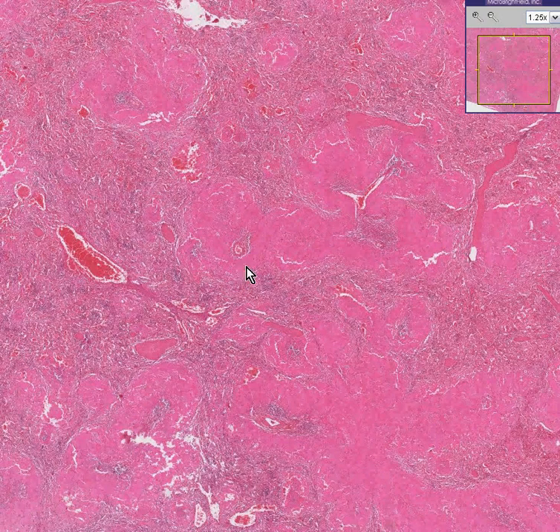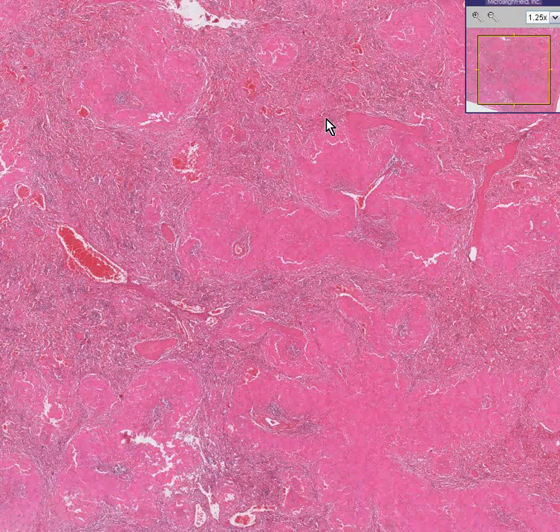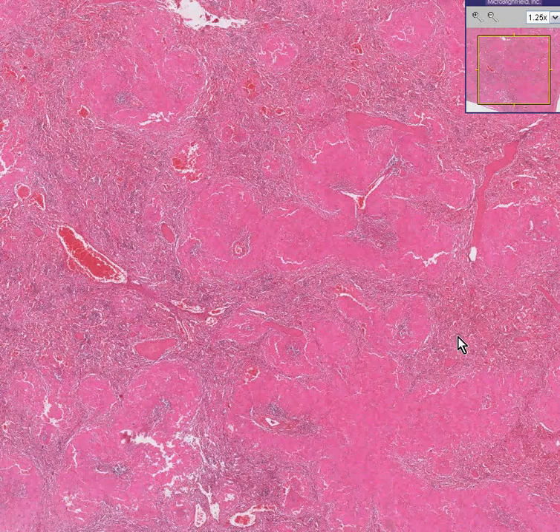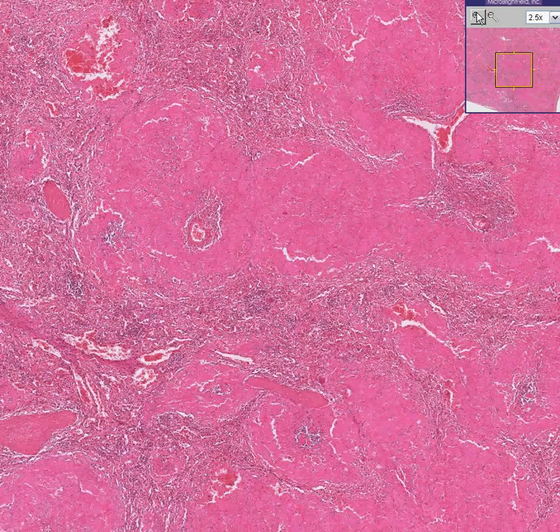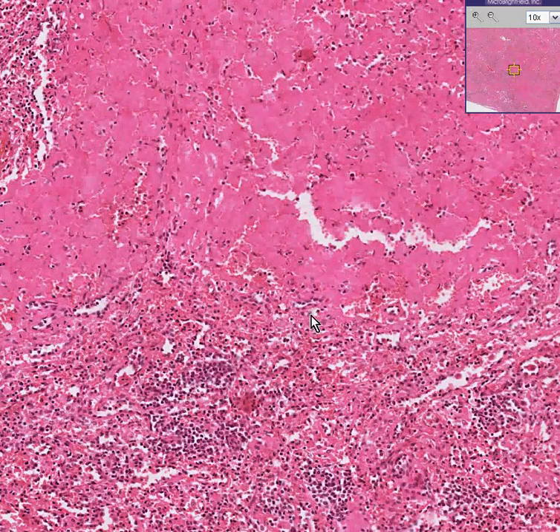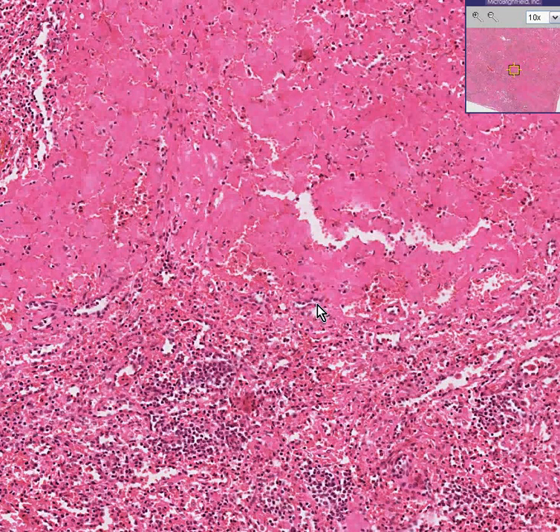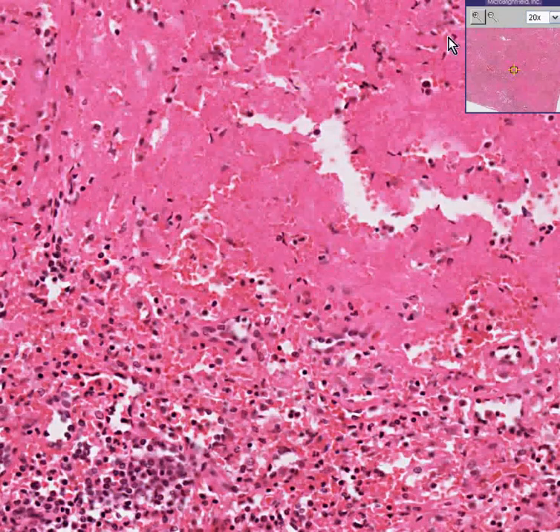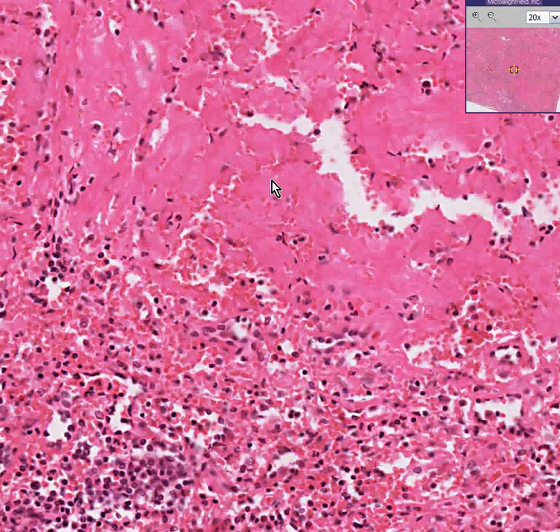more than 50% of it consists of these little pink nodular areas, which are different from the cellular areas. In the cellular areas, we can see cells. We can see perhaps vascular channels, perhaps lymphocytes. In the pinkish areas, we see mostly an eosinophilic material.